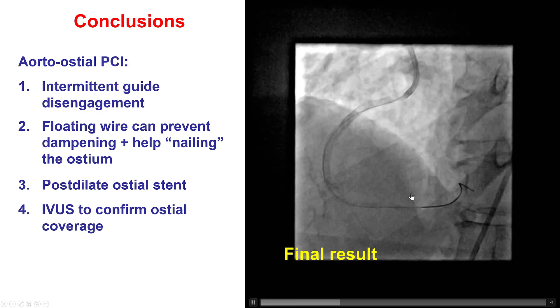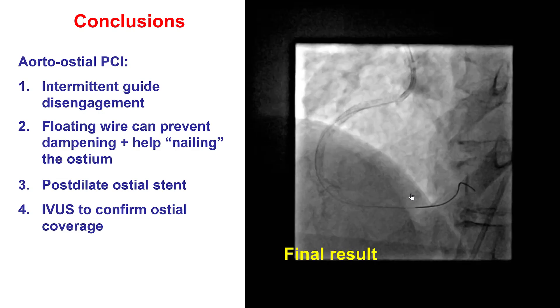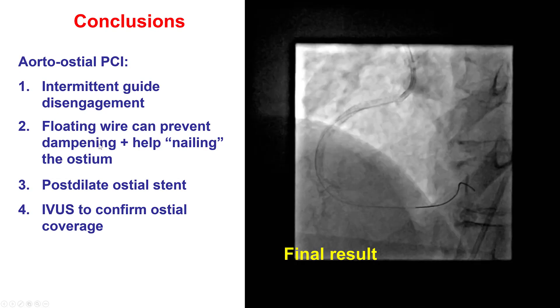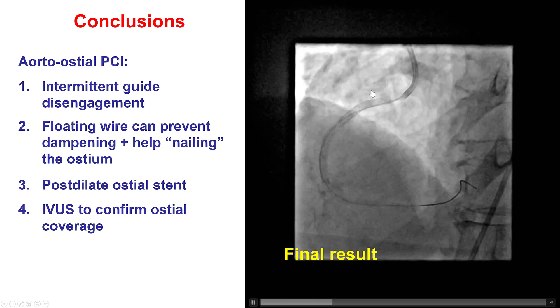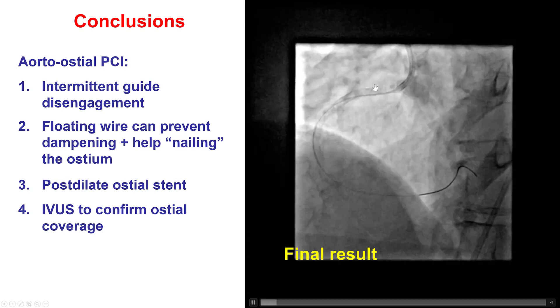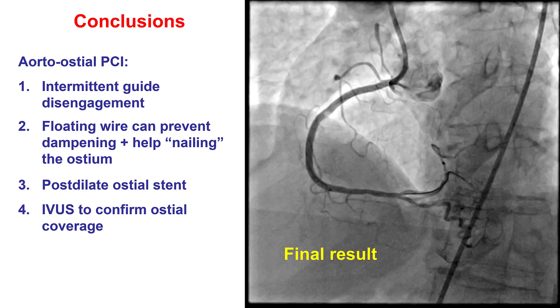Several lessons from this case: first, the importance of intermittent guide disengagement to prevent dampening, or using the floating wire technique to prevent dampening. Also, the floating wire marks the ostium and helps with positioning of the stent so as to nail the ostium and ensure that one to two millimeters of stent come back into the aorta, so there is no geographic miss.